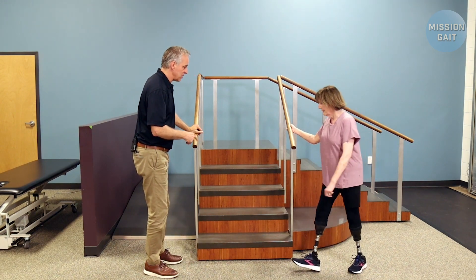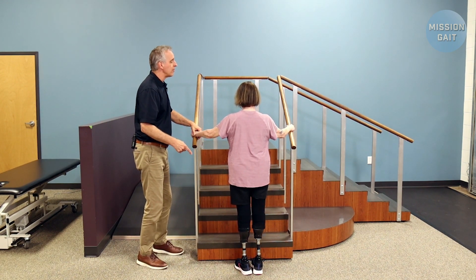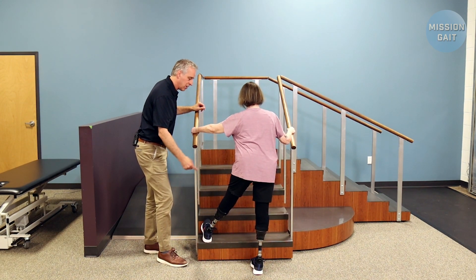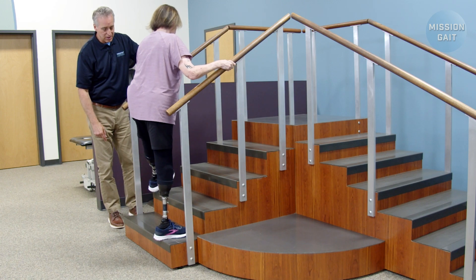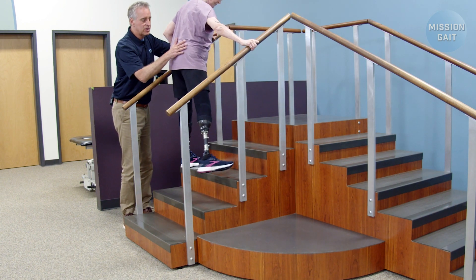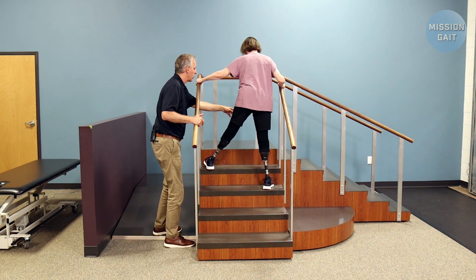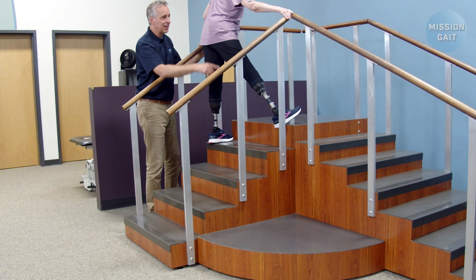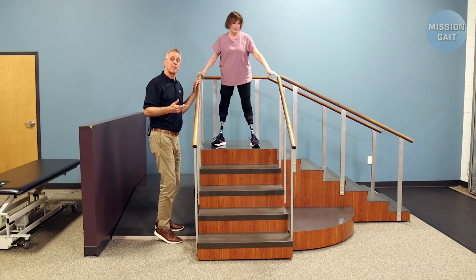Stephanie, come around here with both hands on the railing. Now assume your knees do not bend. Keep one knee straight and put it over here real close to the edge. Rock your weight right into that foot and bring your other foot up to the same level. Notice — the knees are not bending. She's basically leaning side to side to clear the foot, shifting her weight from one foot into the other. You can actually go from here all the way up to the top step. As you get stronger, you can lean right into the rail, go all the way up, and then lean into the next one and pull yourself all the way up.